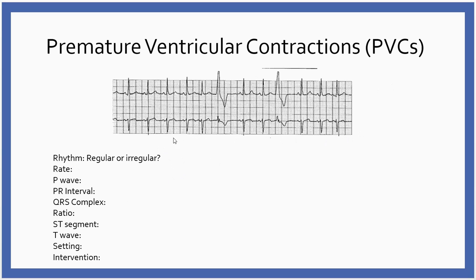Rate, let's see, we've got 6 seconds. 1, 2, 3, 4, 5, 6, 7, 8, 9, 10. Rate is 100, and you'll notice I counted the PVCs. The monitor is going to count that, so we'll count those. So the rate is around 100, so we're a little on the tachy side.